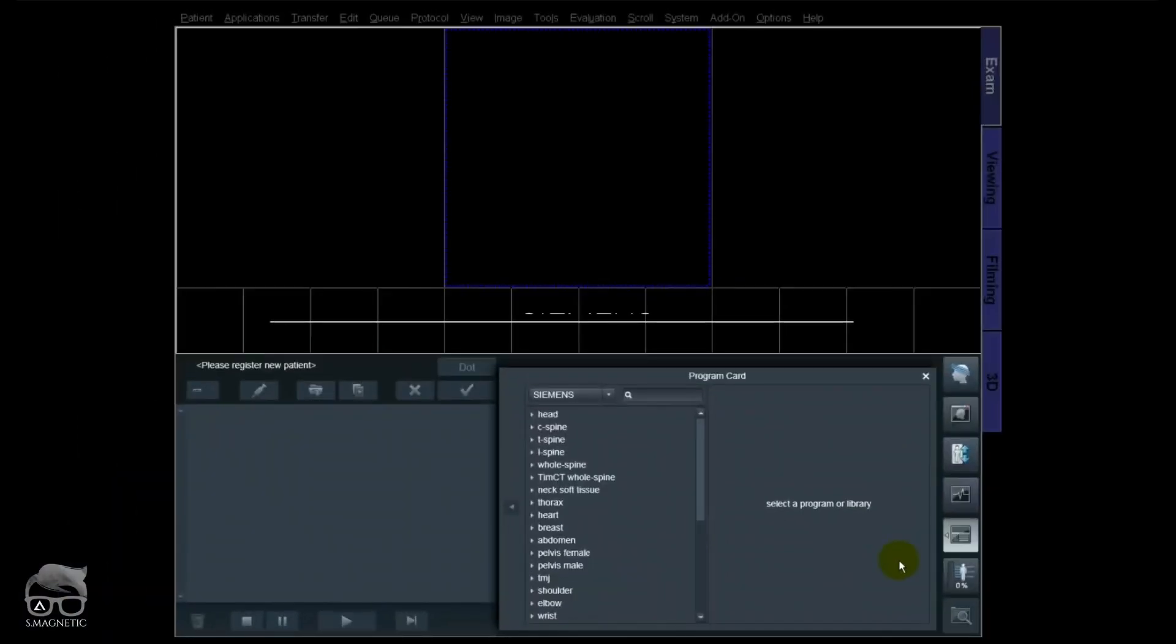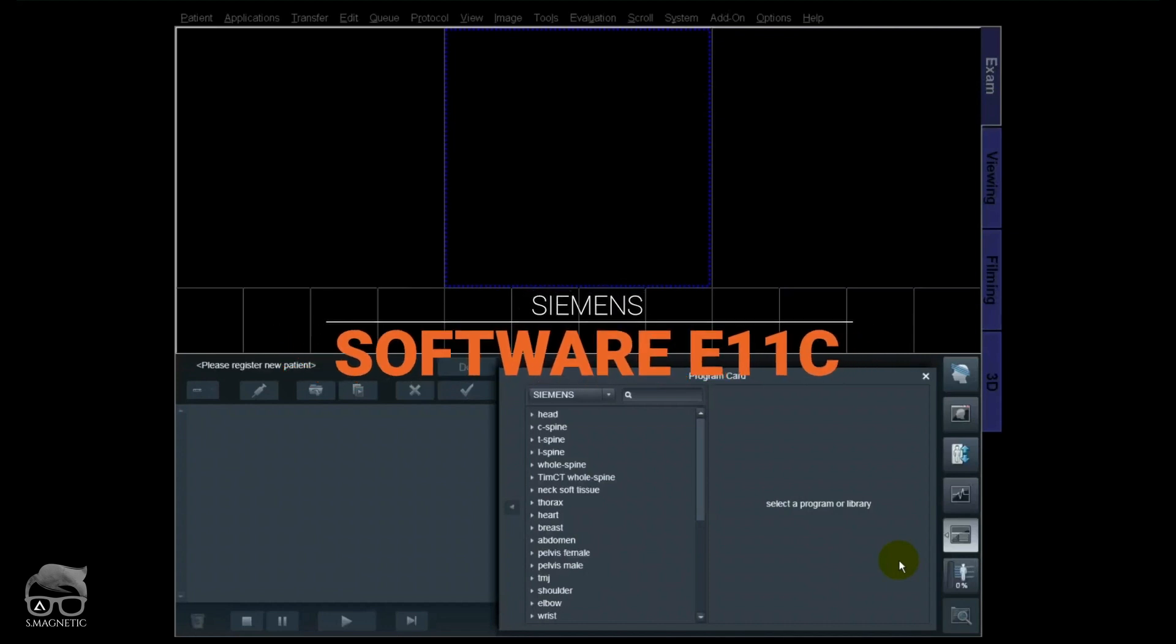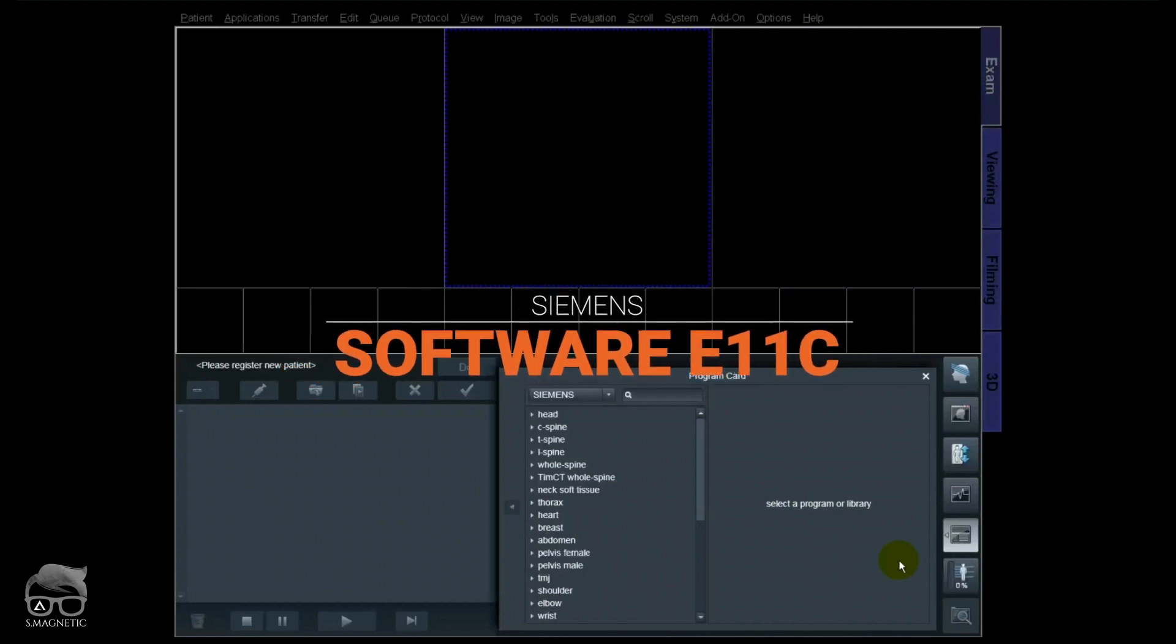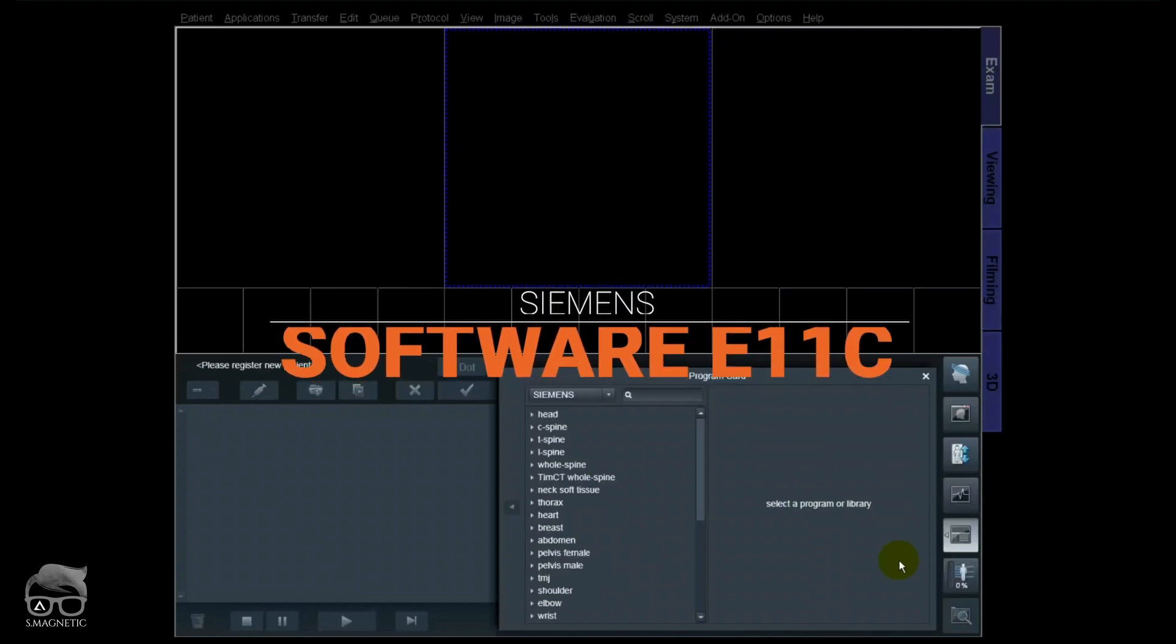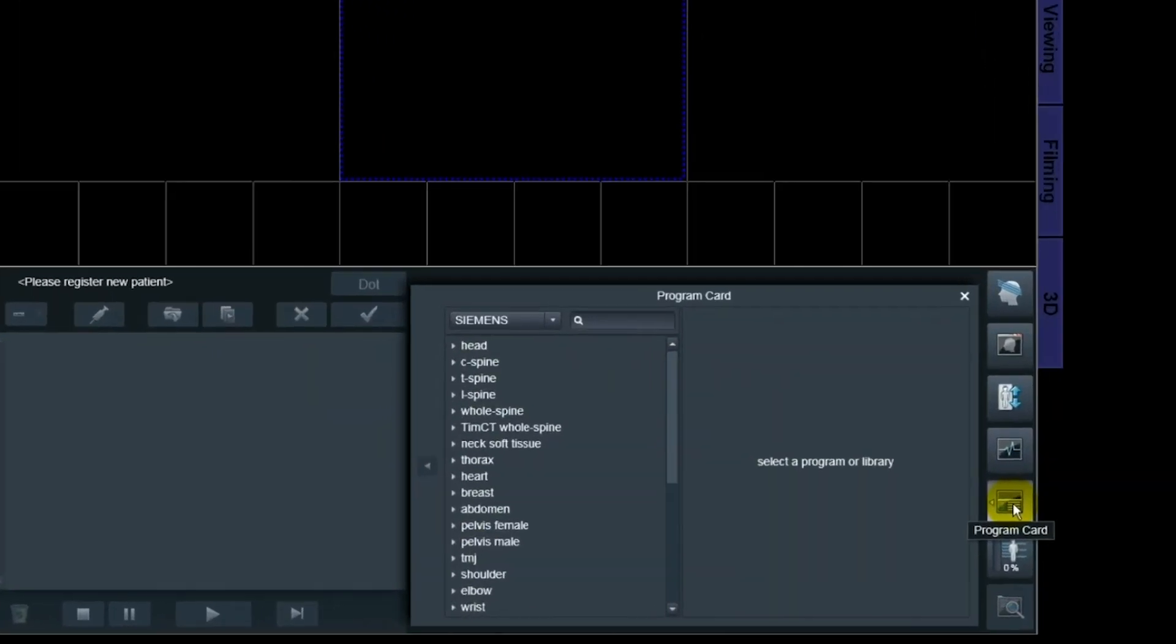This is important as well. Without further ado, let's go to the scanner and I will show you. Okay, we are using the software e11c, but you will see similarities with the old software.